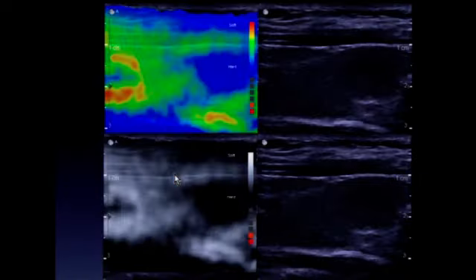So this is the thyroid, which is not taken near the carotid on the B-mode image, but you can clearly see here's the elastogram, which I think if you looked at, you would not be able to tell that there are artifacts. But here on this motion map, you can clearly see the effect of the adjacent carotid artery that's changing the stiffness values.